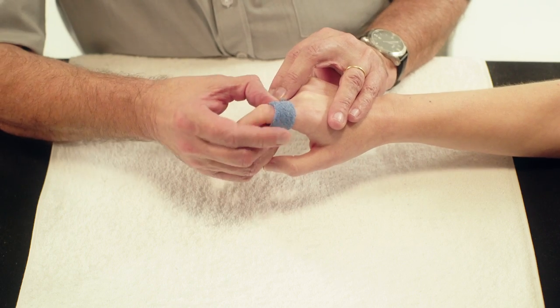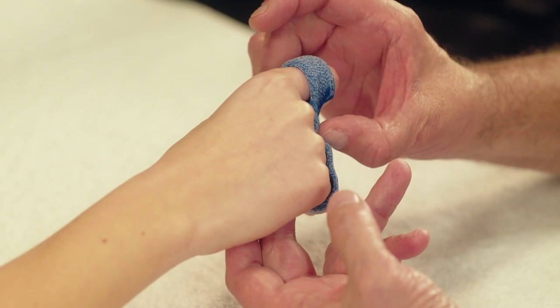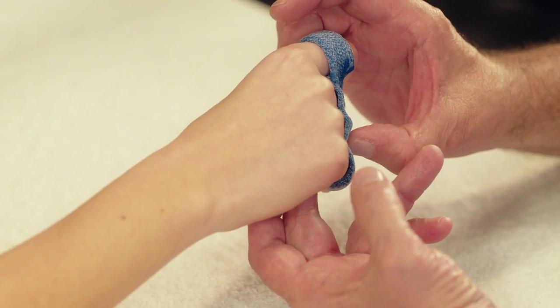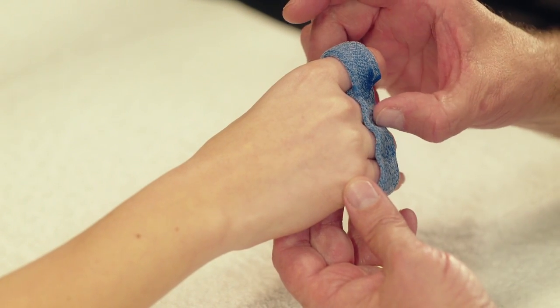Position the fingers in flexion, except for the index finger. Carefully mold the contours of each finger into the material, thus making sure that each finger easily finds its place.